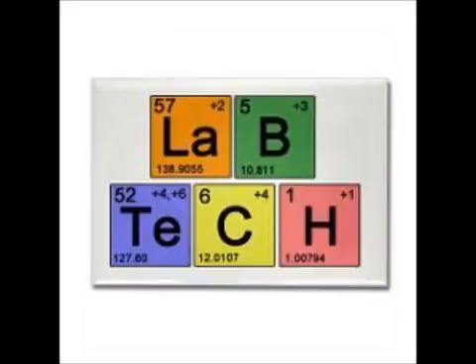Okay, so you're going to have to know that for your test. And you have to know what kind of plasma you use. Platelet rich, because when you do protimes and PTTs, what kind of plasma do you use? Platelet poor. You spin it fast when you're doing protimes and PTTs. You're providing the phospholipid or platelet source in your reagents. So when you're doing a protime and PTT, you want all that removed down on the Buffy coat. So you've got to know platelet rich plasma, and you look for clearing, more clearing as the platelet aggregation occurs.